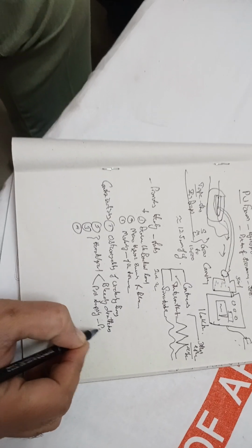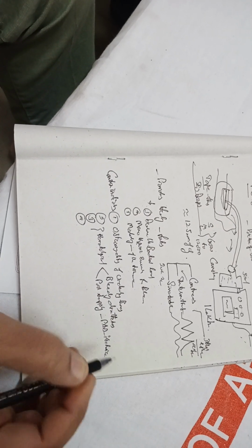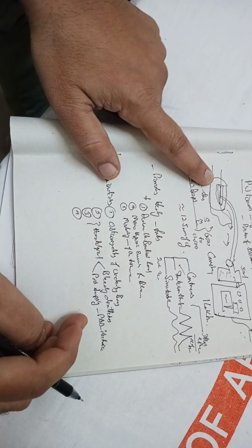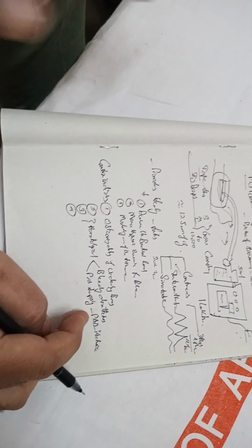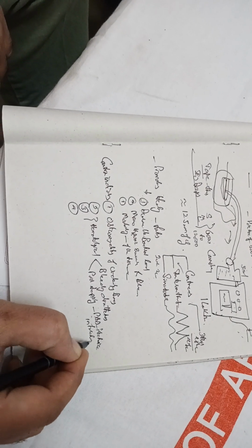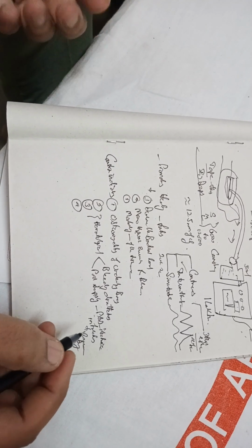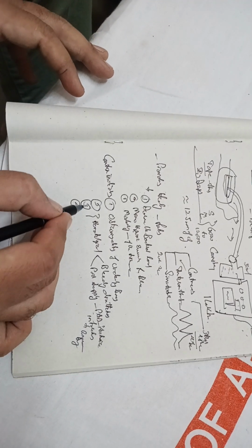That means you see in peripheral arterial disease, already an ischemic limb. For a wound to heal, there should be supply. If you apply VAC, you are trying to make it heal, but supply is not there. It will lead to infarction of the wound, and it will lead to gangrene, dry gangrene. So that wound will worsen. So these two are the second and third.